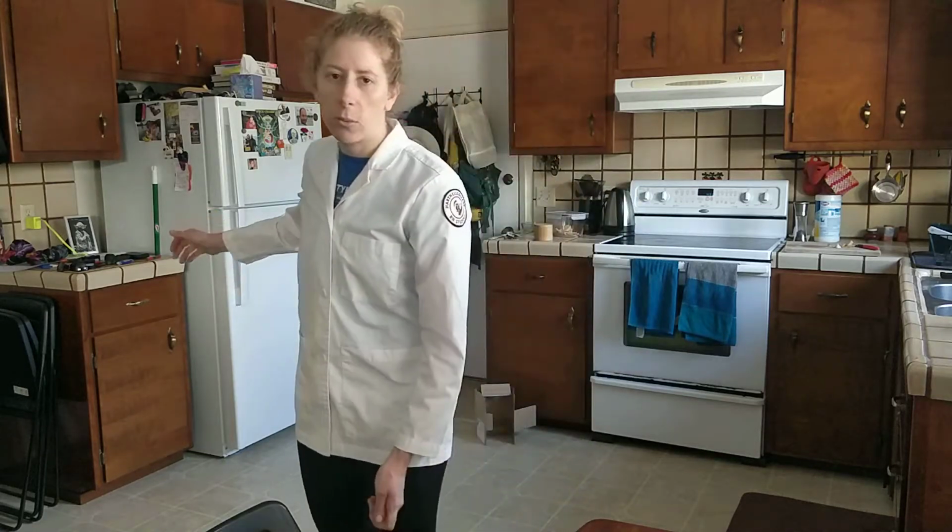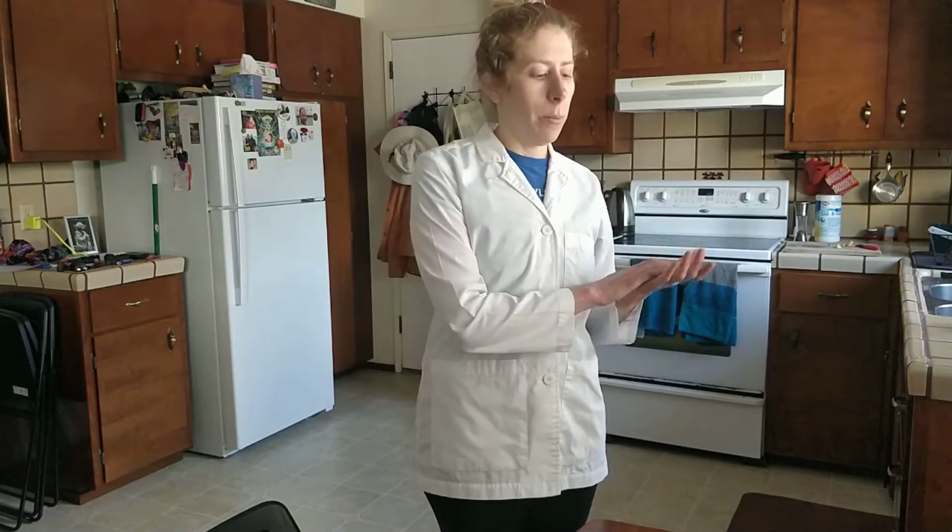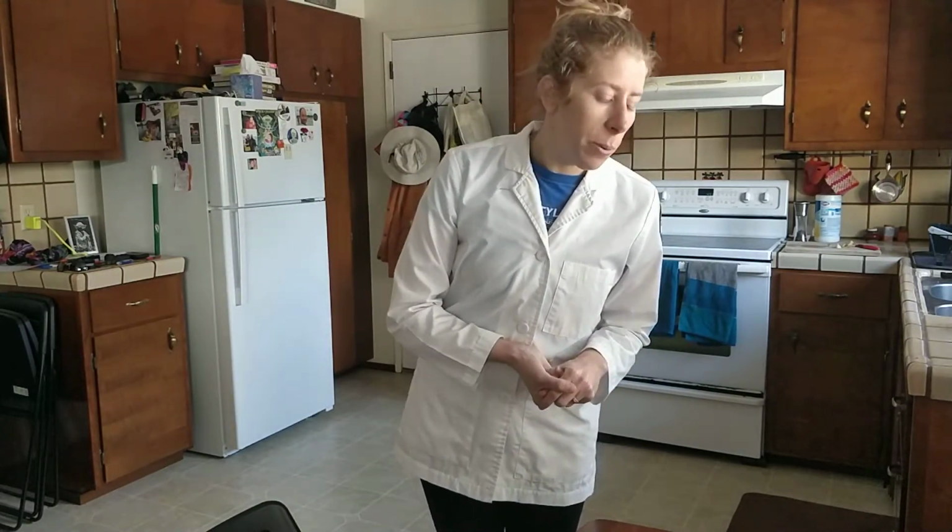I'll enter the patient's room, provide for privacy, introduce myself, perform hand hygiene, use 2 patient identifiers to identify the patient, and explain that I'm going to be pushing some medication through their existing IV line. I will assess for allergies, making sure that they don't have an allergy band for which the medication is not listed in the computer system. And I will also assess for pain.